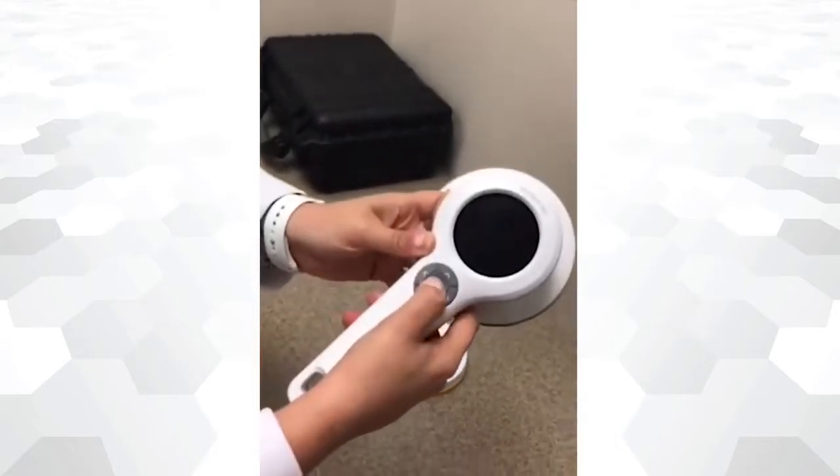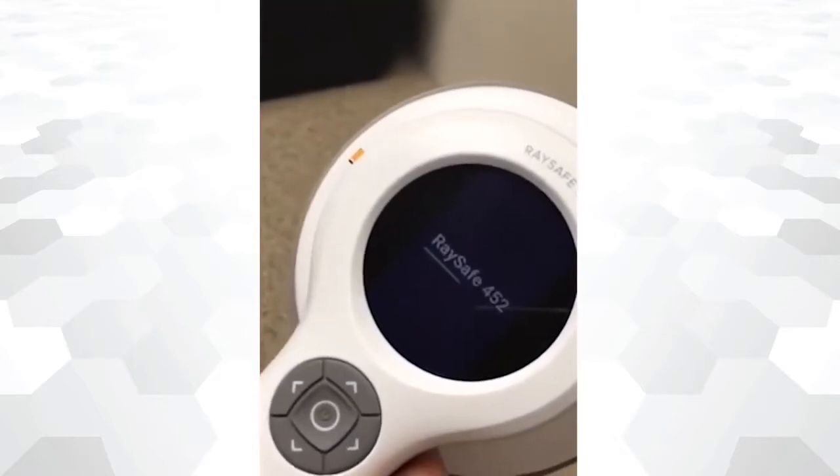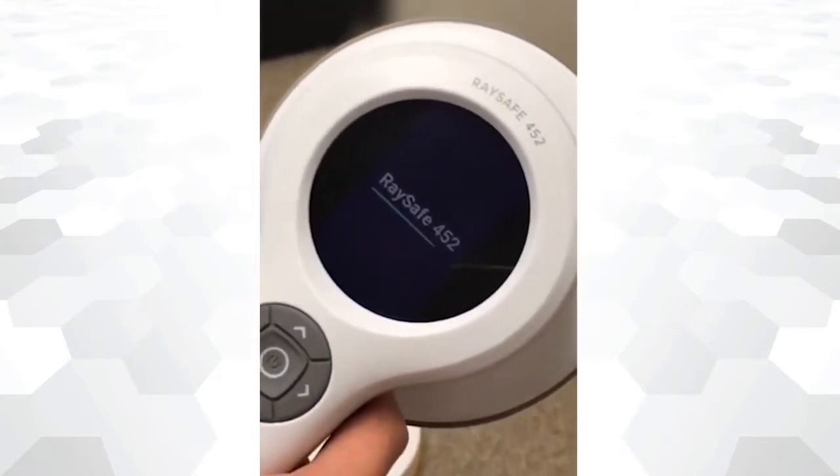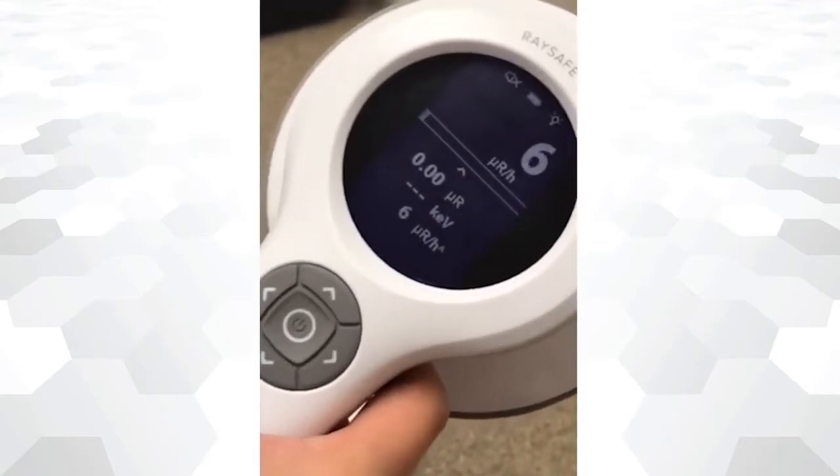The device is now ready to use. To power on, press and hold the center button. The device will take around five seconds to initialize. The main screen is composed of several sections.